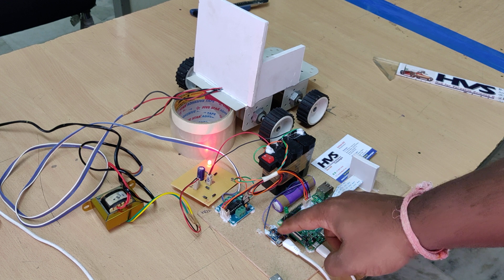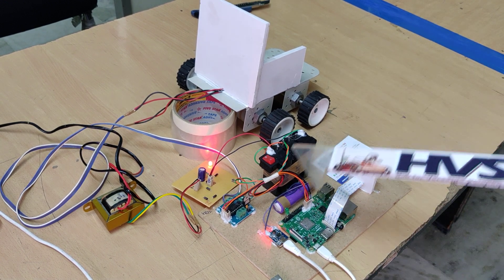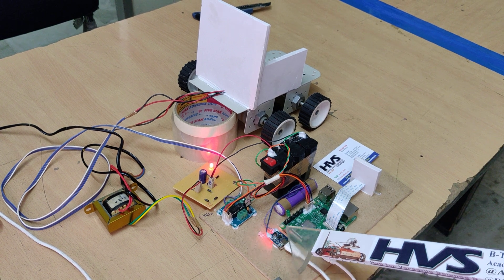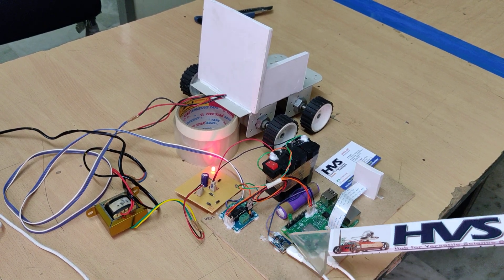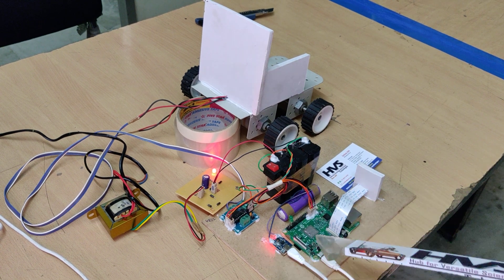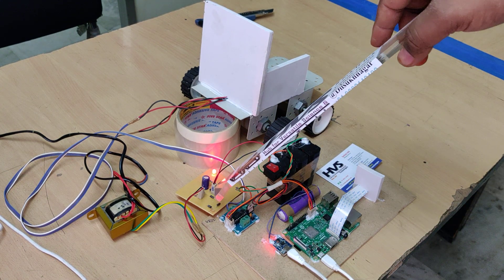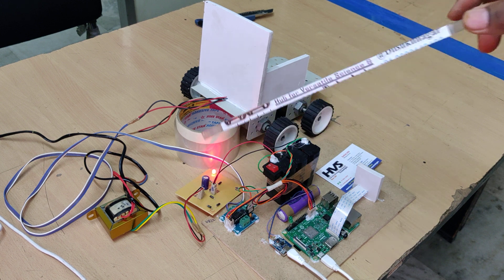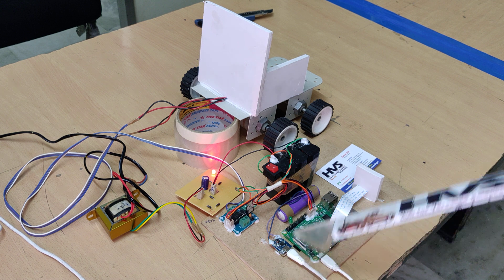Whenever the light is blinking, it indicates the battery is charging. Once the blinking stops and the light stays on continuously, the battery is fully charged and you can remove the charger.